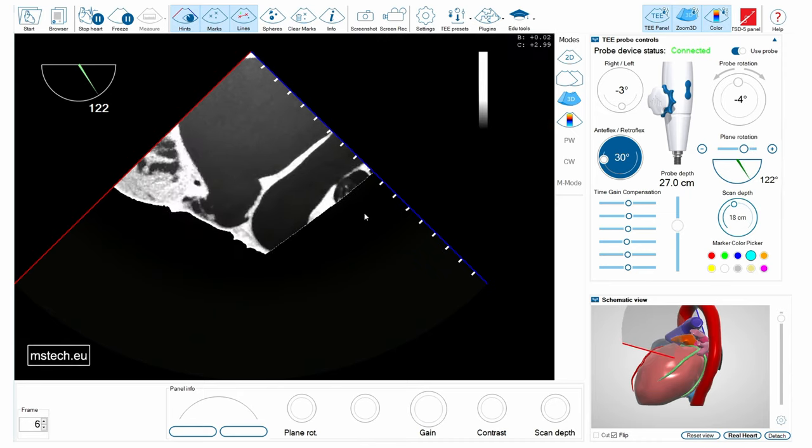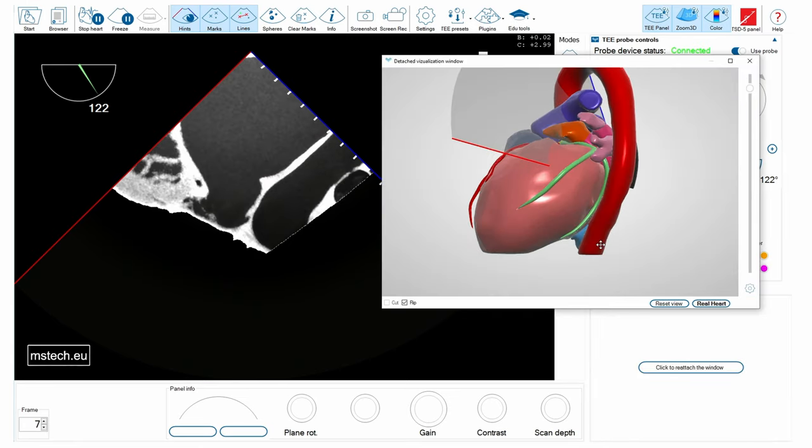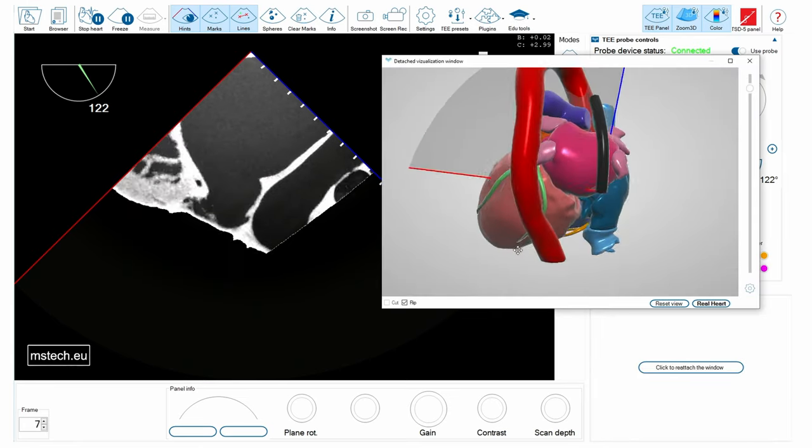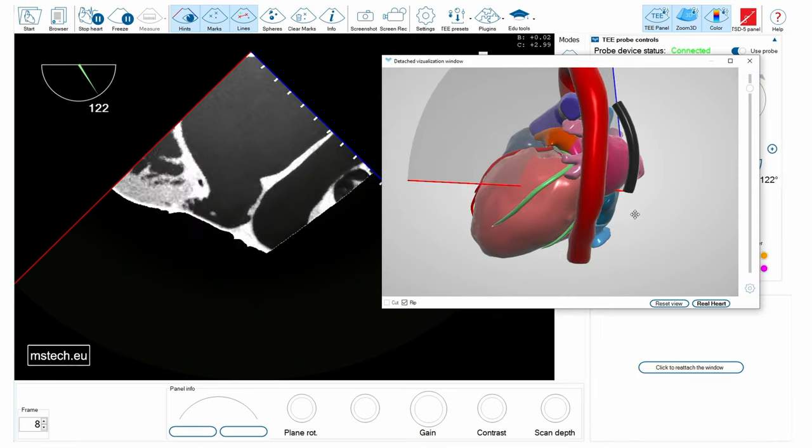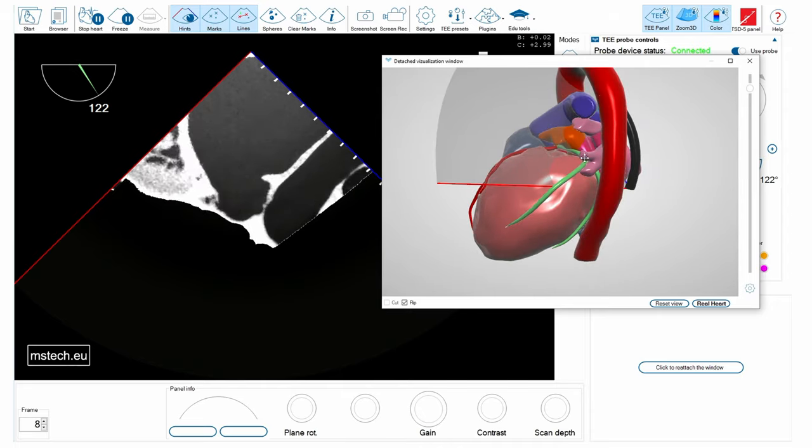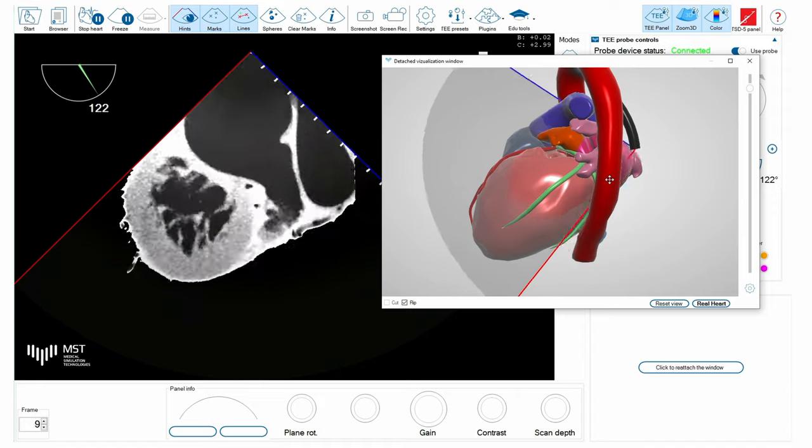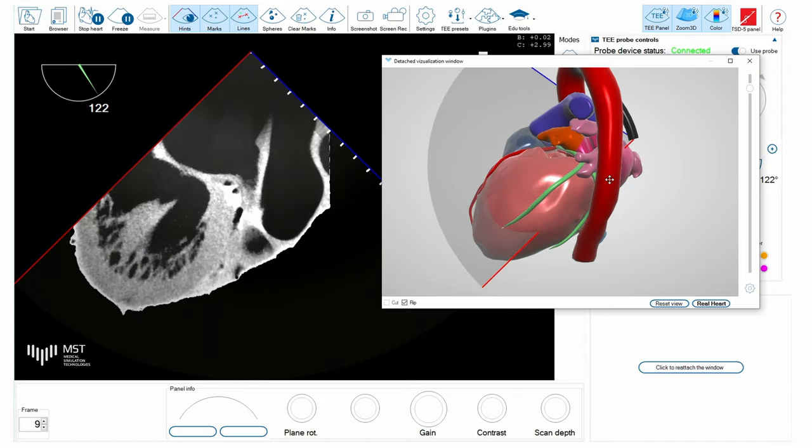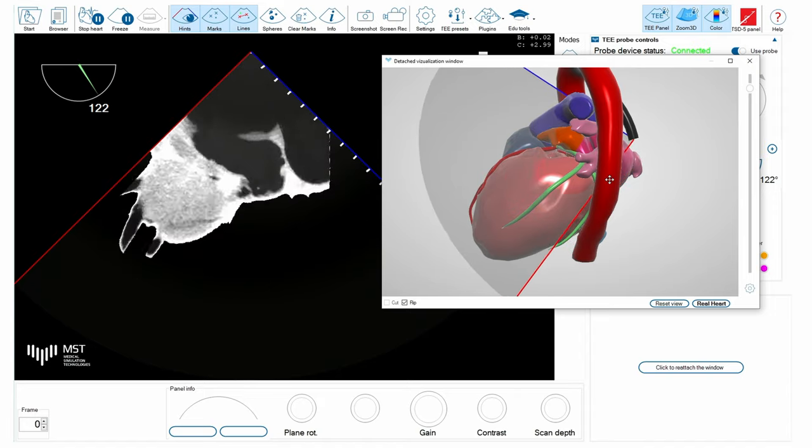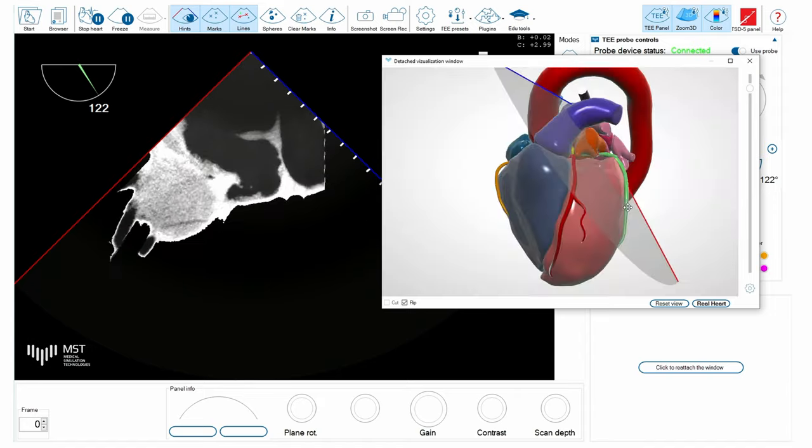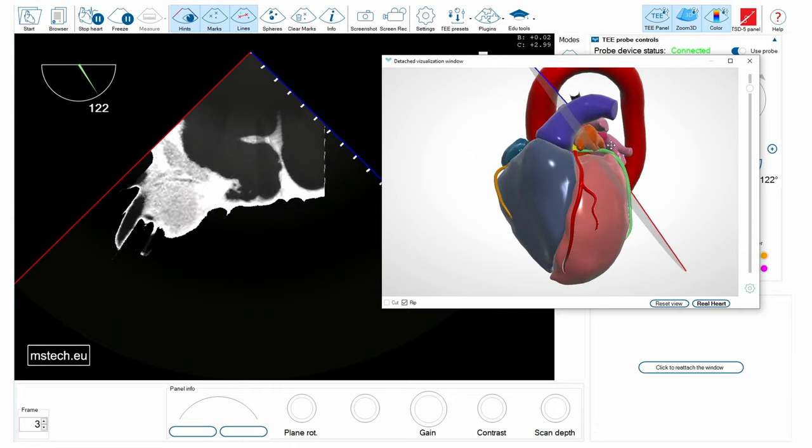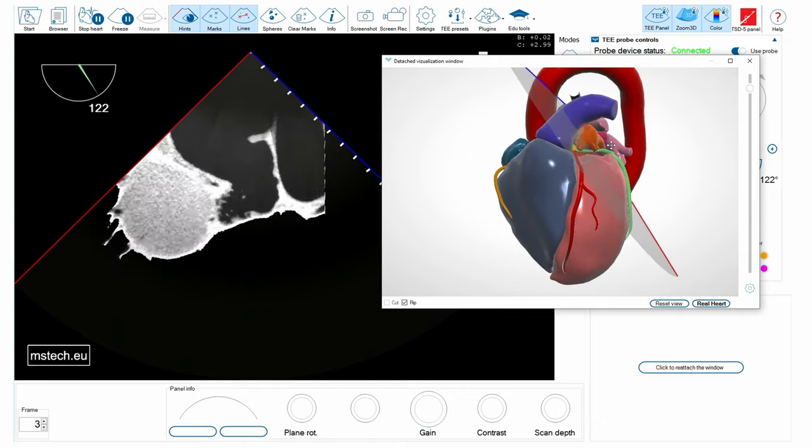To understand the anatomy, it's also good to look at this model here. So we are now scanning the left atrial appendage from below instead of scanning it from behind the left upper pulmonary vein, which creates this Coumadin ridge problem which obscures the view.